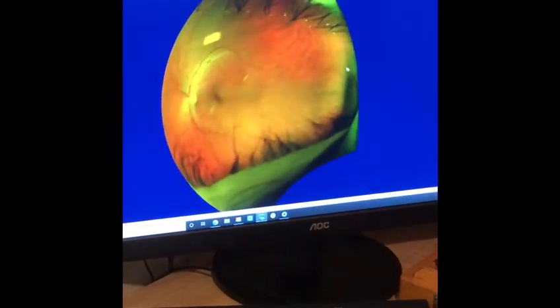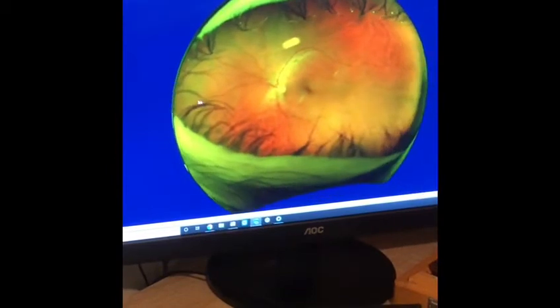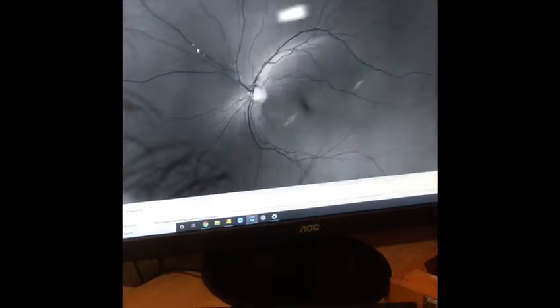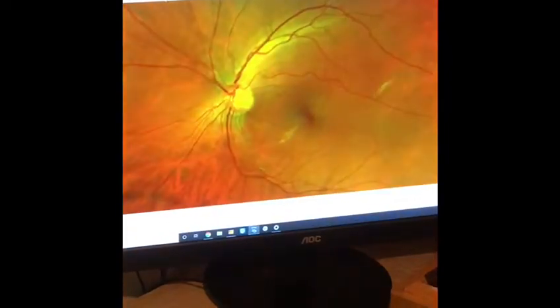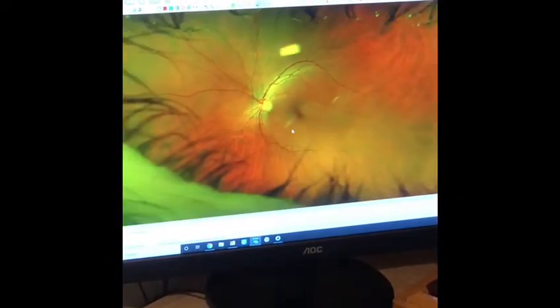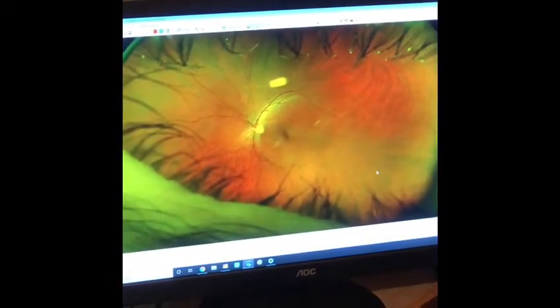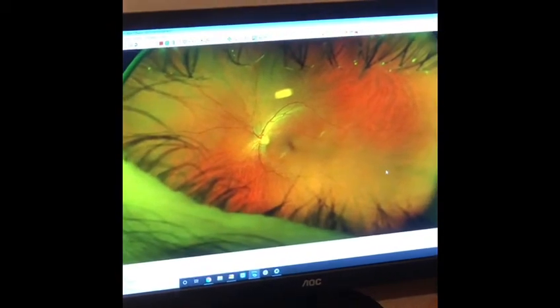So we can see right to the outside of the retina, to the inside, and then we can actually zoom in on the important structures at the back of the eye, like the optic nerve here, and assess with different filters, different layers of the retina. Thankfully, this looks pretty healthy, and in most cases the Optomap just reassures us and you, the patient, that everything is normal and healthy. But in some cases it will show signs of general health changes like blood pressure, diabetes, cholesterol, as well as specific eye health conditions like macular degeneration, glaucoma, and retinal tears and detachments, to name a few.